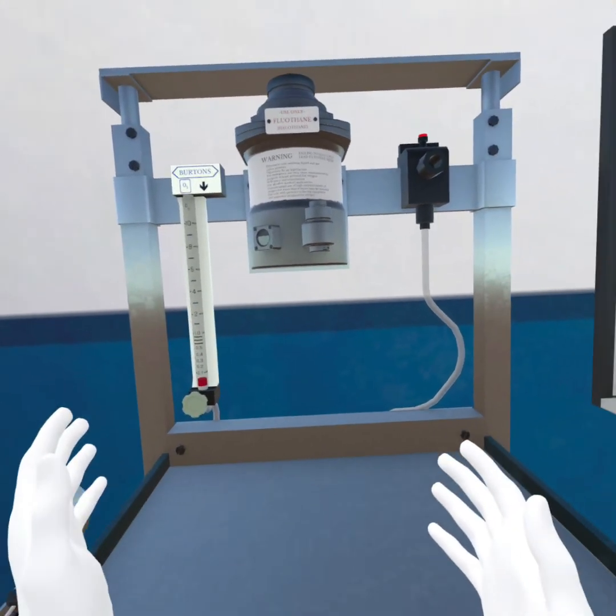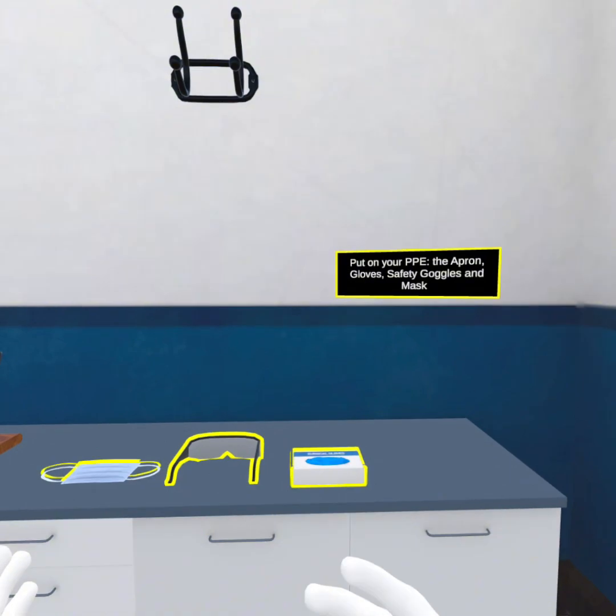Put on your PPE: the apron, gloves, safety goggles and mask.